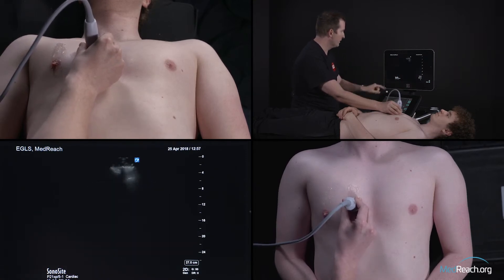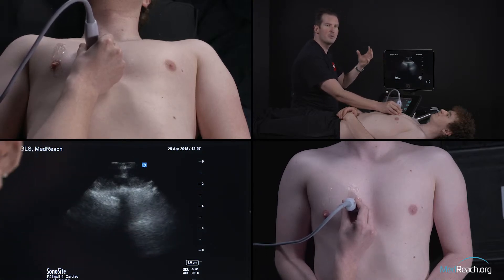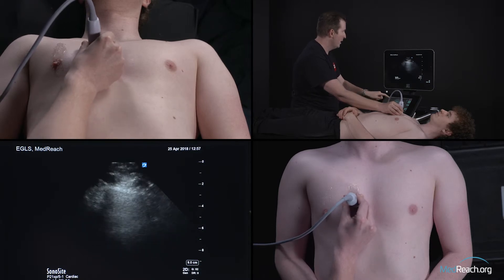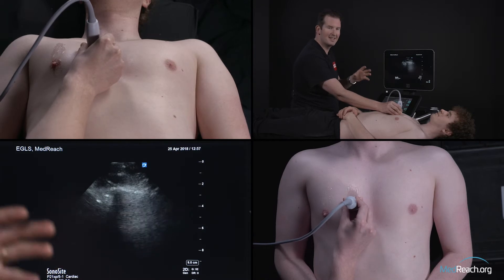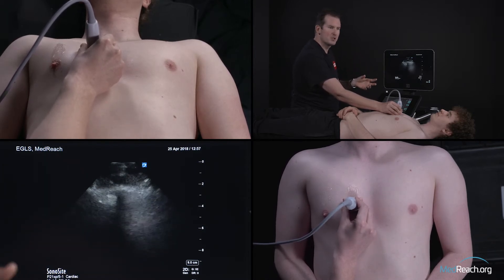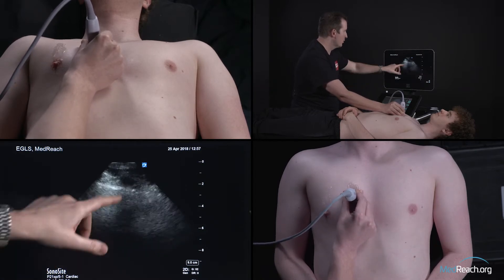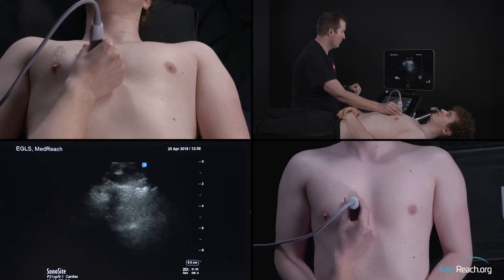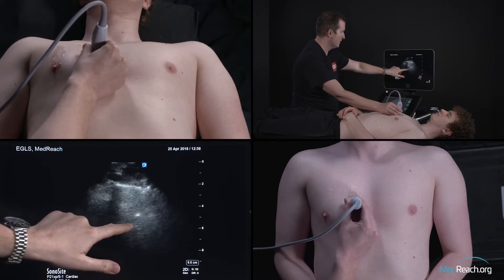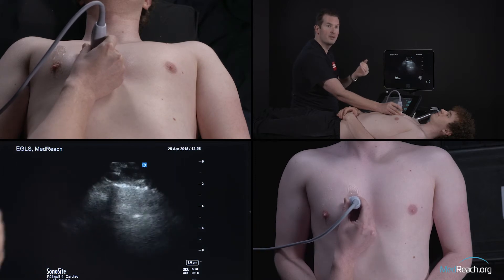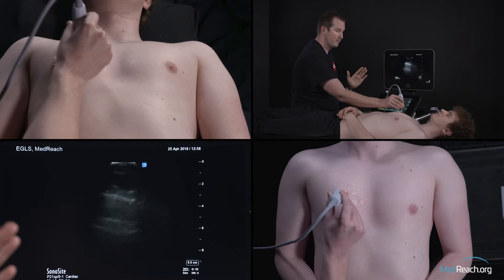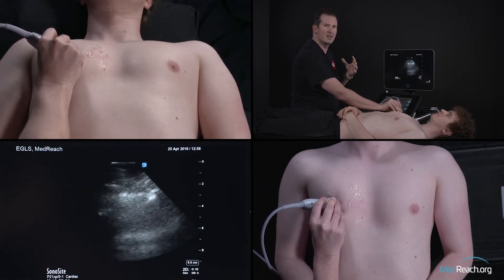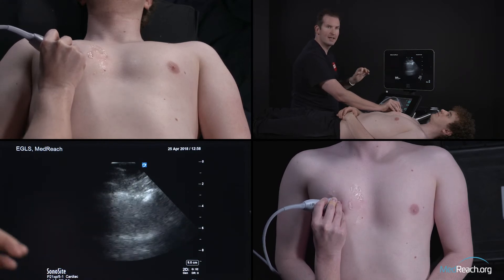Let's immediately decrease depth to magnify our structures in the near field. As you go from far field to near field, you see how it gets brighter. No B-lines, so I decrease depth, then adjust gain so I see the pleura as well as possible. One pitfall of the phased array probe is that it's meant to fit between the intercostal space, so you might not see the ribs as well. You may need to move up a little bit, center on the rib, see the shadow, and identify the rib — thus confirming that bright echogenic line in the background is the pleura. As I tilt the probe, the A-line disappears, and as I become perpendicular to the pleura, it reappears. By staying perpendicular to your structures both medially and laterally, you optimize your image. The A-lines and the pleura are equidistant — that tells me technically I have the best image I can get of my patient's pleura.